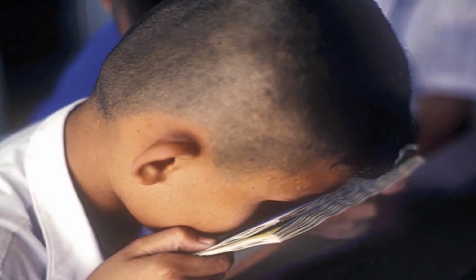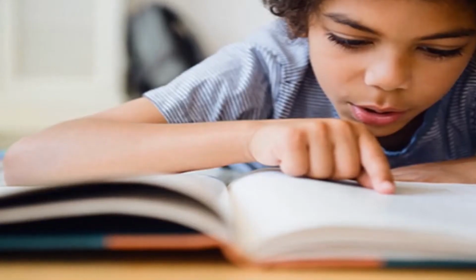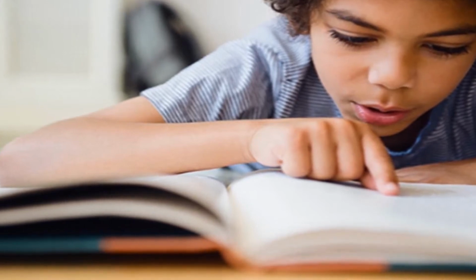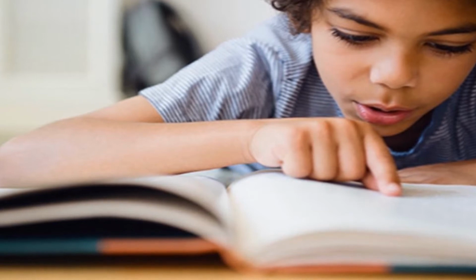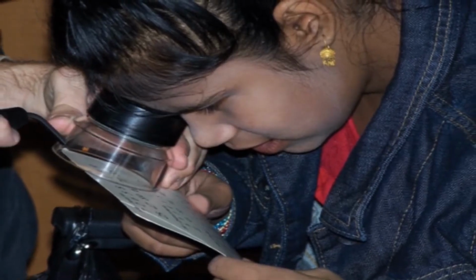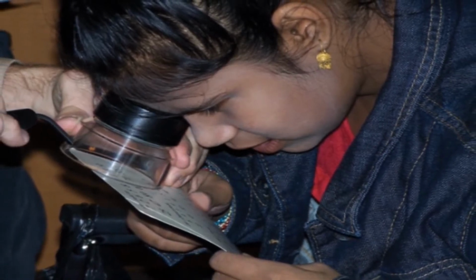Low vision aids. Most children with low vision can significantly increase their near visual acuity by employing their strong ability to focus on nearby objects or by squinting to produce a pinhole effect if they have poor accommodation. Children with low vision normally achieve the required magnification by the approach method, that is, the relative distance magnification. Some children need optical devices along with relative distance magnification to see the target clearly.